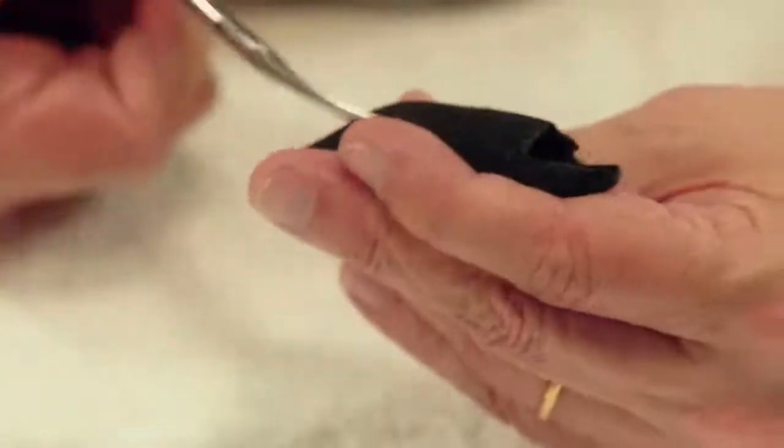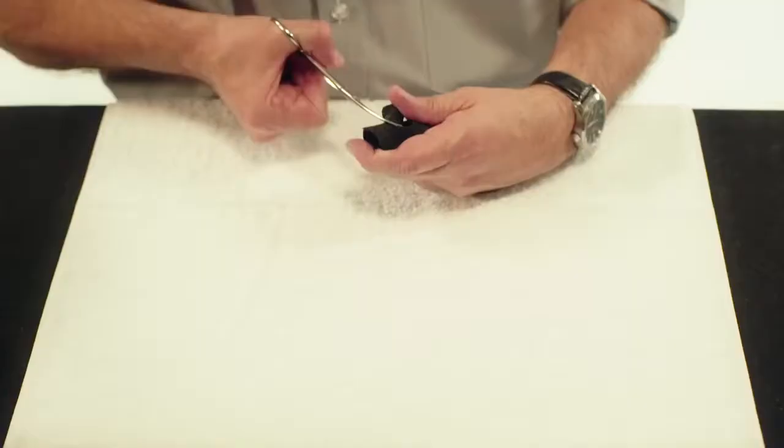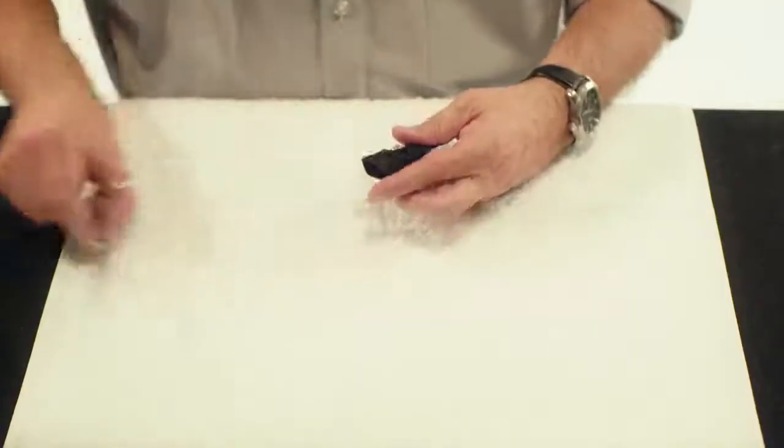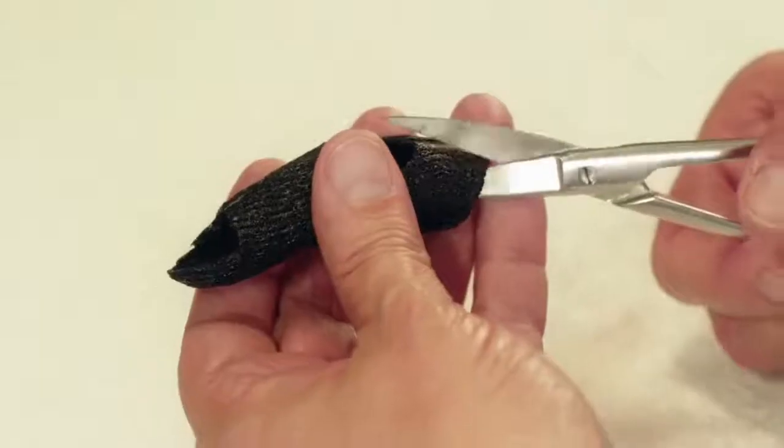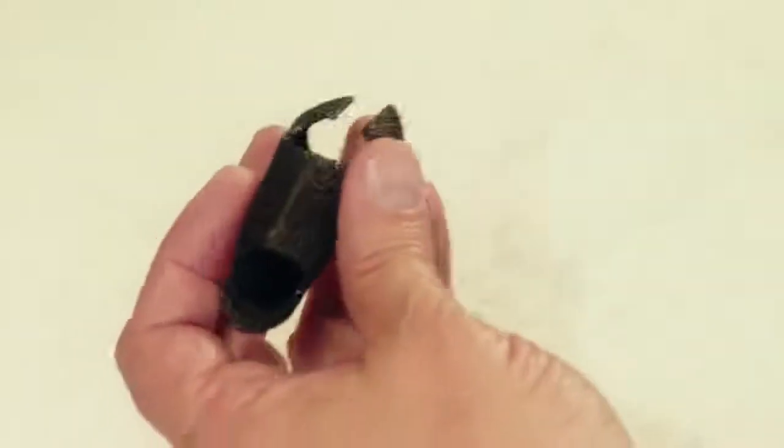Cut out an opening for the PIP joint. Finish the orthosis by trimming excess material on the dorsum of the first phalanx.